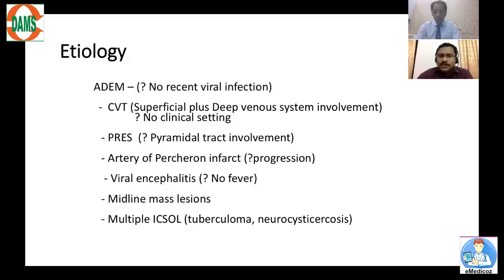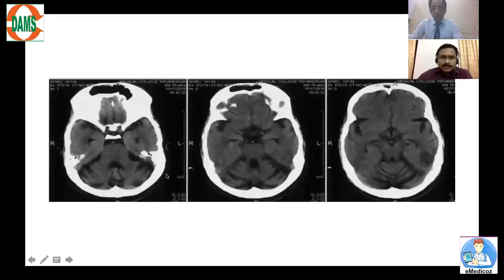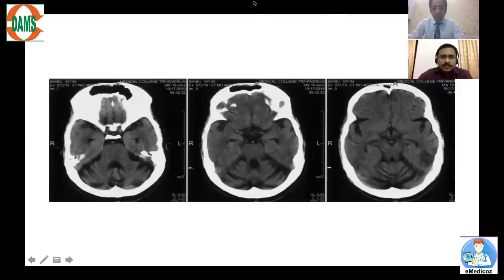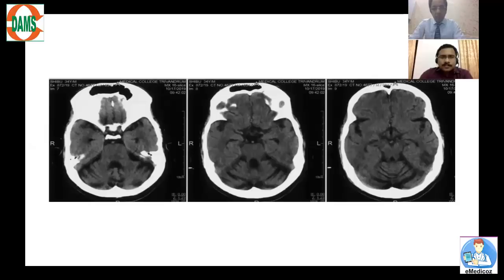Moving to the non-contrast CT findings. Going from below upwards, the first outstanding feature is that the cerebellar folia appear much more prominent than in a normal patient. Comparing cerebellar foliar prominence with the cerebral sulci, there is out-of-proportion atrophy — an element of cerebellar atrophy that was unsuspected on clinical details. We have to think of causes like long-term alcohol intake.